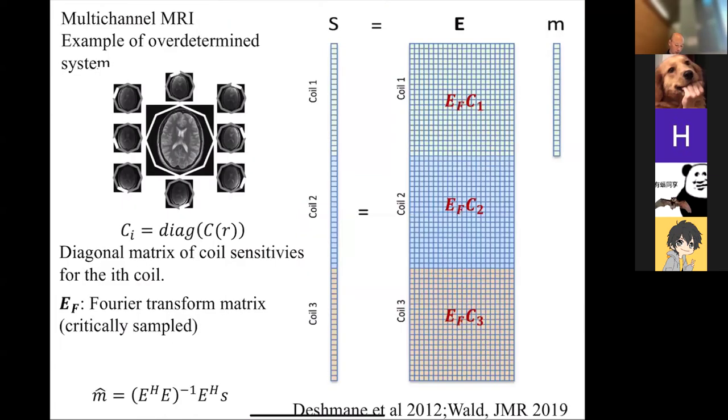Okay, this was the overdetermined case where we basically have an overdetermined set, and we're going to review this just because we want to review this idea of coil sensitivity. So the idea is once you have multiple coils, the key insight is each coil only sees part of the object now. If I have a coil here, it's going to be fairly sensitive to the spins close to it, but not so sensitive to the spins out here. So there's going to be a drop off in sensitivity.